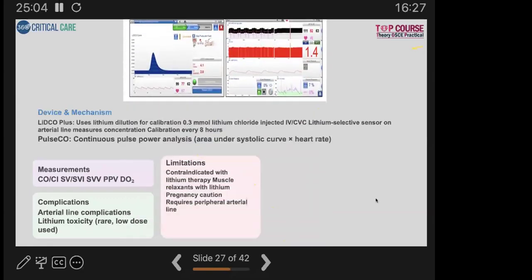So can someone tell me what this image shows us? Of course, it is the same area under the curve, but it is mentioned in the picture itself.